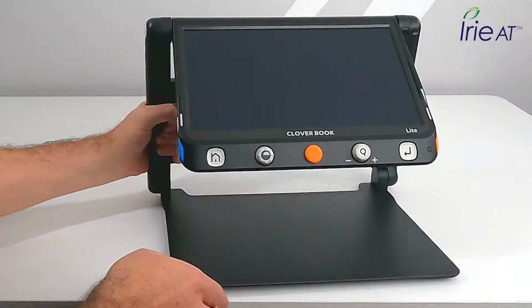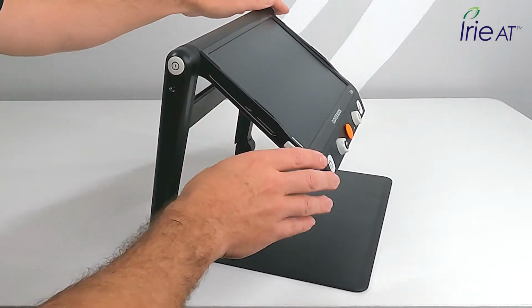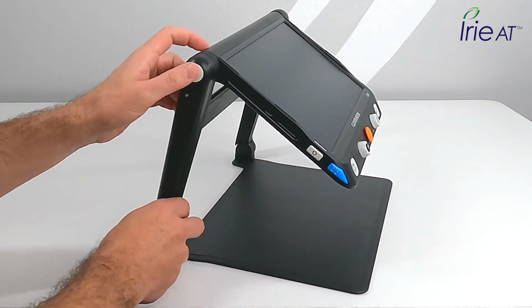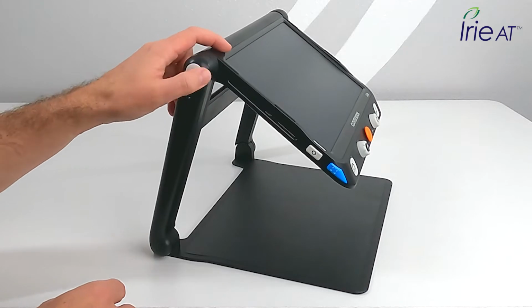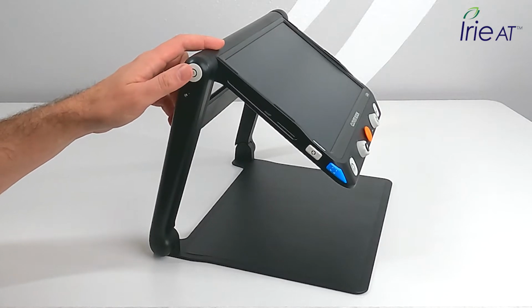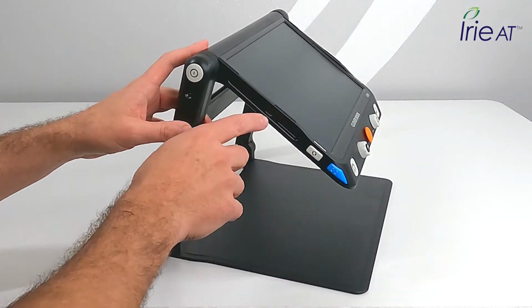So let's take a quick look at what we've got here. There's two arms that hold this on a base, and then the main part of the unit and the controls are on the screen that come out from the arms. On the left arm on the top, we've got a bit of a tactile round button. That's our power button. That'll turn on a green light when we have the unit on. I'll turn that on in just a second. I'll show you the function of the buttons as we go through them, but I wanted to point out a few things before I turn it on here.